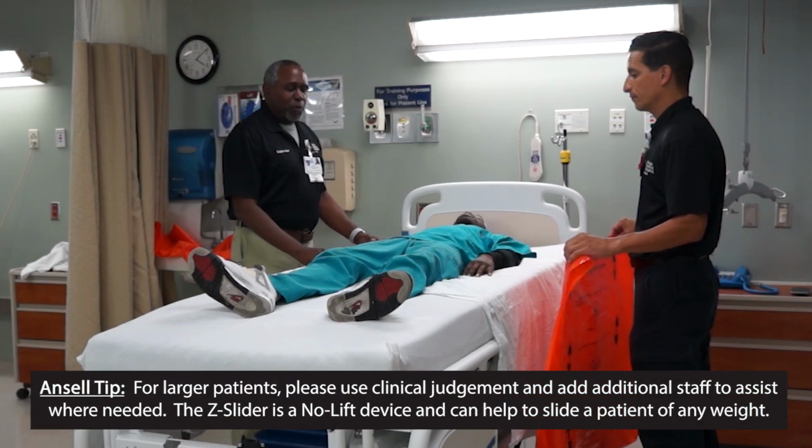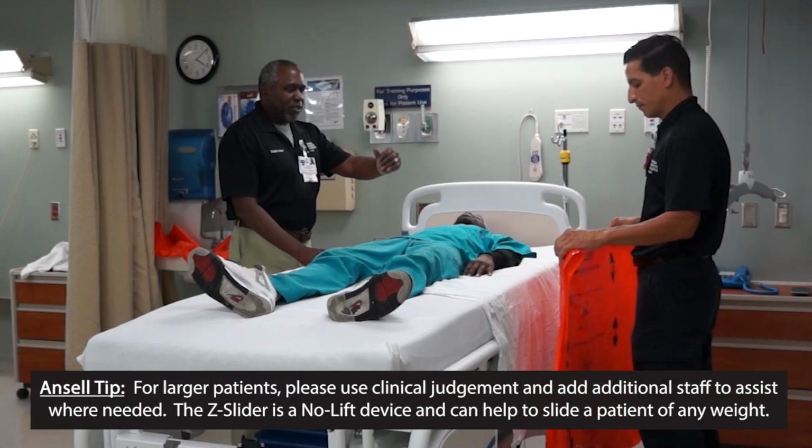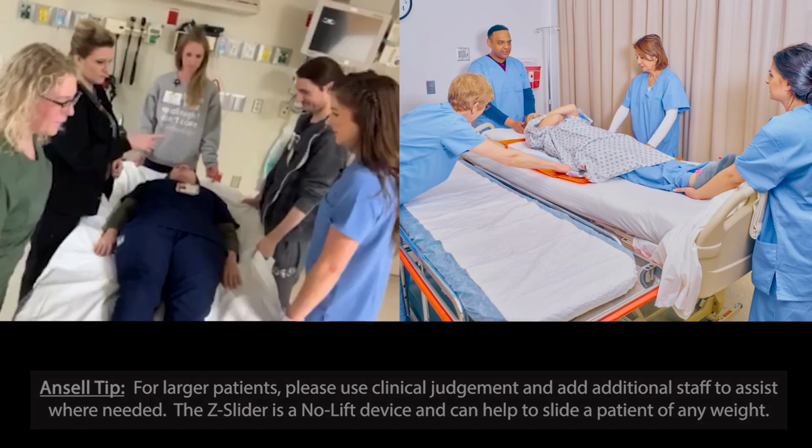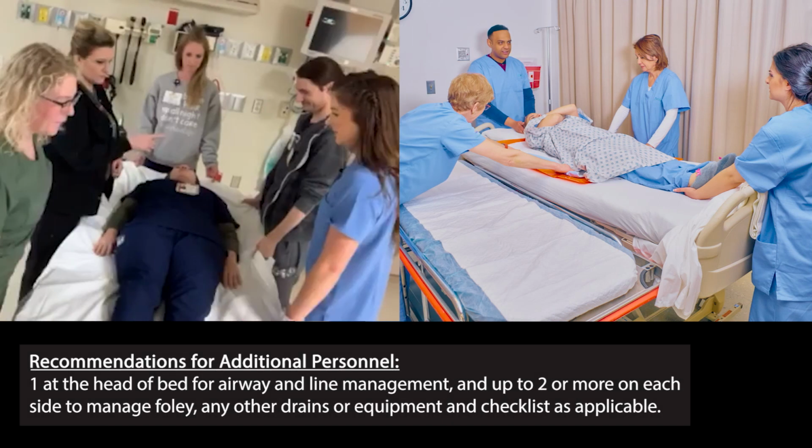Going to demonstrate how to prone a patient on the same surface using the Z slider. So this would be manual application. Recommendations for additional personnel: one at the head of the bed for airway and line management, and up to two or more on each side to manage Foley, any other drains or equipment, and checklist as applicable.